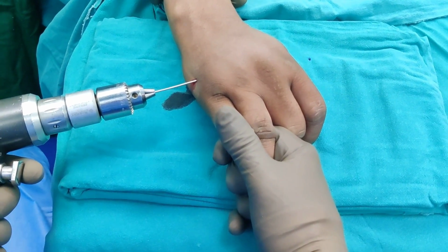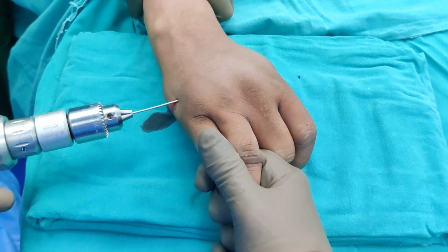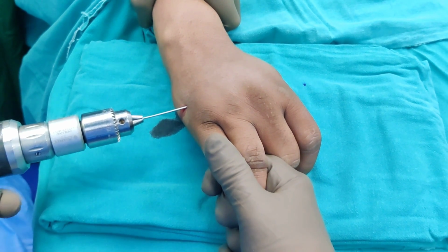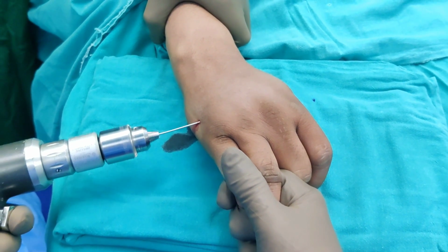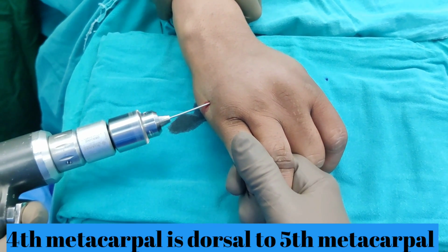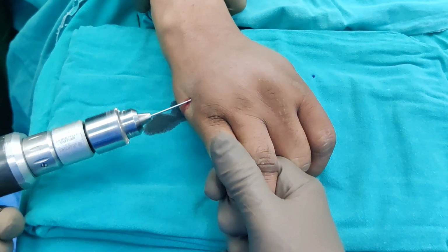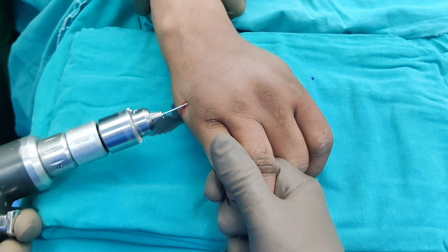So the first thing is I'm going to pass my wire, which is the distal wire. I've taken the image on the C-arm and it is just a centimeter distal to the fracture line, and then I'm going to pass the wire. And you have to angle it slightly upwards because the fourth metacarpal is slightly upwards. So I'm going to pass like this, and you go in a transverse fashion. And once you go past the fifth metacarpal, you will find the resistance going away, and then you will find it catching the other metacarpal.